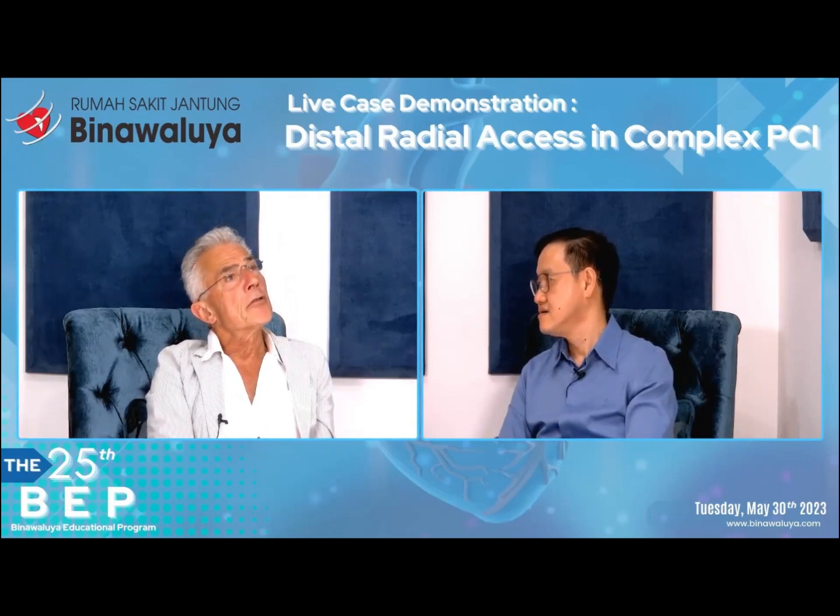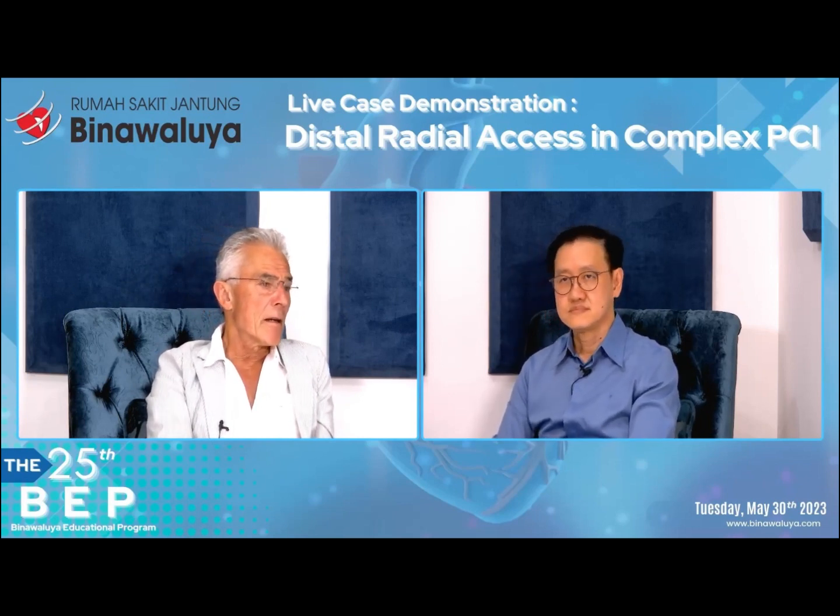So usually, for how long, if you do a complex procedure, do you remove it? Well, of course there are several factors. You shouldn't consider it as a sport to reduce compression time. You have to be fair. In some patients with, let's say, 4 or 5 French procedures, and the patients are not hypertensive, they are not overly anticoagulated, you can remove a bandage within an hour.